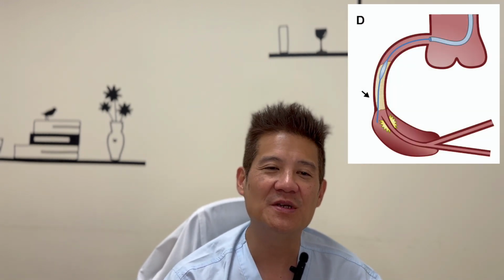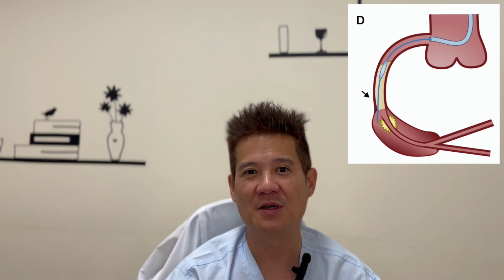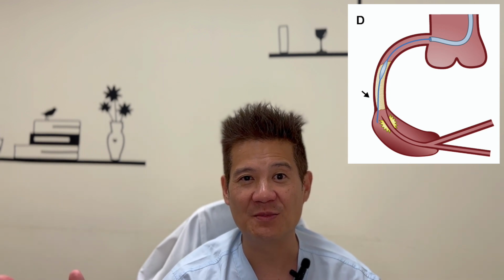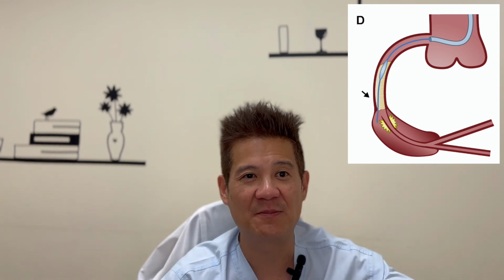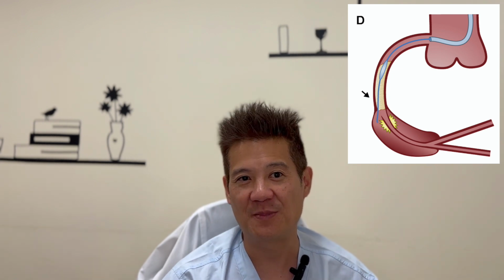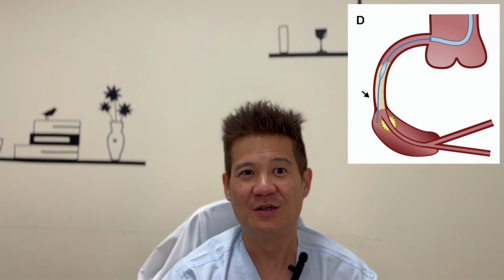For distal vessel hematoma expansion, the problem is you collapse the distal vessel and you don't get good runoff. One solution in the paper is to put a small, low-pressure stent in the distal vessel to keep things open. And you can always bring the patient back in 2 to 3 months and upsize the stent. In fact, that's what happened 2 days ago with the 0.85 balloon that I ruptured and caused the hematoma. We put a 2.0 by 38 stent in the distal right coronary up to the bifurcation. And we had great outflow. So the patient is coming back in December for us to blow the stent up back to 3.5.